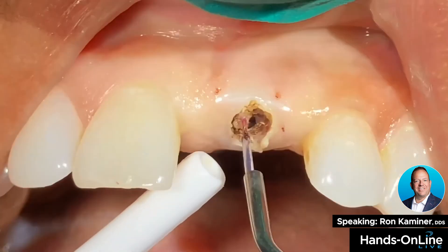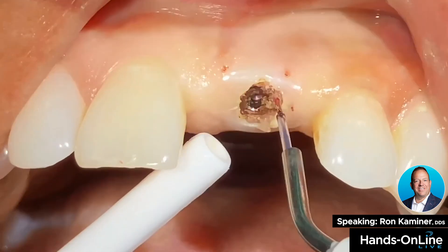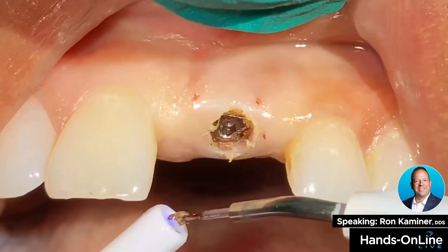You can see how quickly and readily we're able to uncover this healing abutment. Now I'm literally on the implant itself, but there's no transfer of heat.